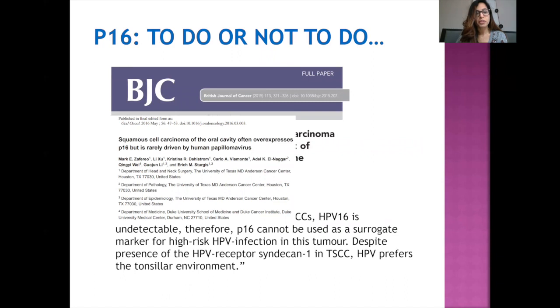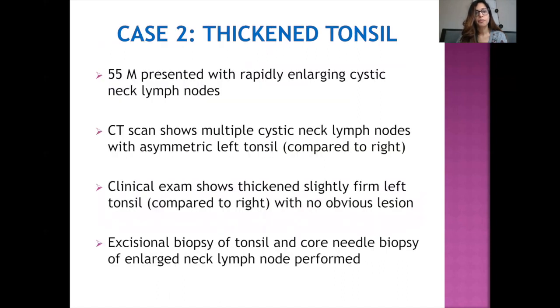And here's another paper that essentially says the same thing, where squamous cell carcinomas of the oral cavity often overexpress P16, but rarely are driven by actually HPV pathogenesis. So we actually don't do routine P16 or any other high-risk HPV testing in the oral cavity.